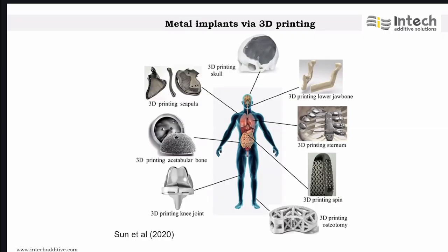And then we have this knee joint. It's about total knee replacement. It's been printed using the powder bed fusion process, and it produces the strength required for load bearing joints, especially the knees. And we have the lower jawbone, where you can make customized jaw reconstructions which fit the patient anatomy, and it's not like the off-the-shelf approximation.